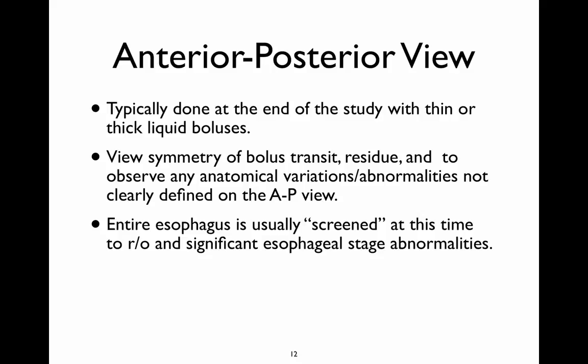So stroke patients spring to mind, who could have unilateral impairment of action of the vocal folds and the pharynx and the oral structures. So you're looking to see, as the bolus material goes down both sides, how symmetrical that is. You're looking to see if there are any weird anatomical variations that weren't clearly defined, and that shouldn't say AP view, that should say on the lateral view.